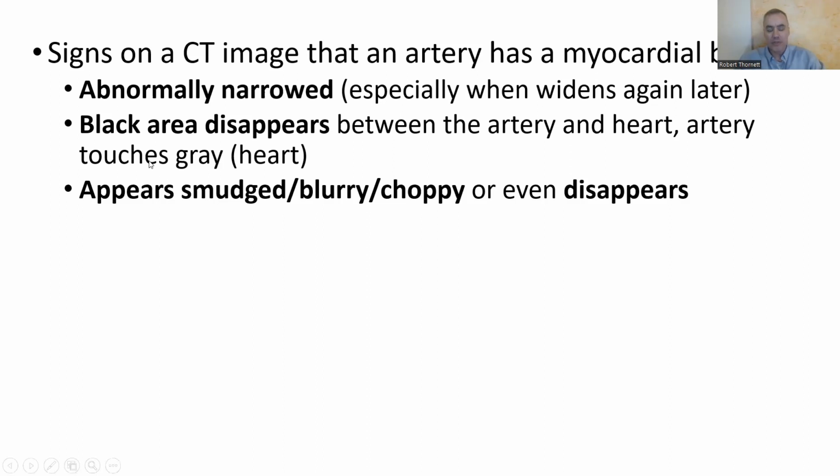And secondly, and this is the big one, this is one I didn't know and Stanford explained to me, is that the artery is actually not supposed to be in the heart. Your main coronary arteries that feed your heart are not supposed to be in your heart. They're supposed to be around your heart and sitting in fat. There's this globulous yellow fat all around your heart, that your heart sits in, and the arteries are supposed to be just sitting in there.